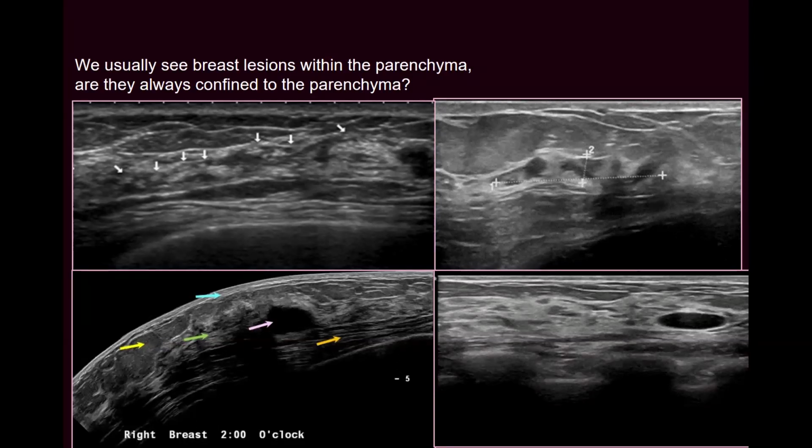From blood vessels also, excellent. There are vascular lesions. Lymphatics, yes, excellent. What else? From the fat, maybe. From the fat, excellent.